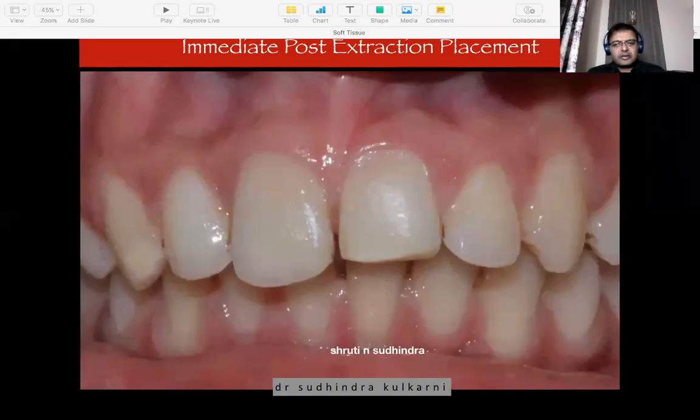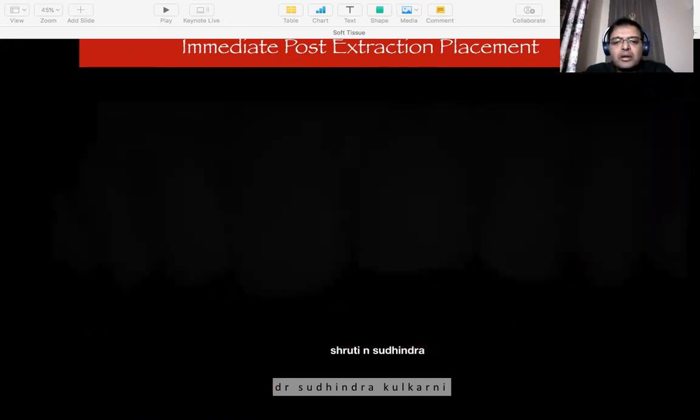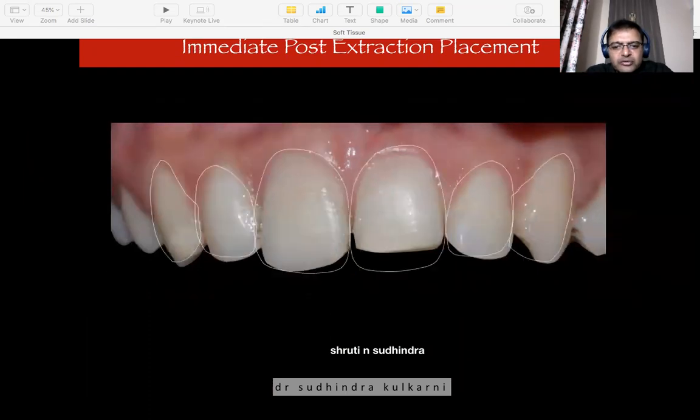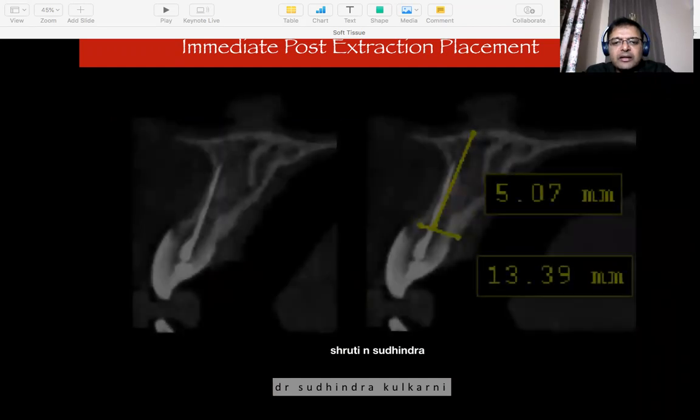The next set of cases is where you have to do a simultaneous hard and soft tissue graft to get better aesthetic outcomes. Let's look at this case. It's 2-1, which is an ankylosed and resorbed root situation. It needed a bit of aesthetic work, some DSD planning there.